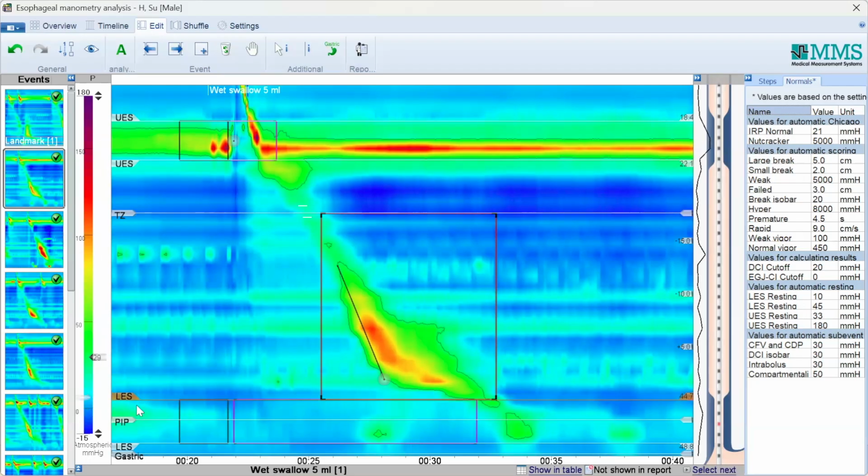You can see that this is the blue one. It's almost zero, dark blue, like minus. Going up to green, yellow, that means more pressure. For example, here in the middle, it's orange or red, which is high pressure, which is normal. The question we can ask is why the pressure increased in this part, not in this part.